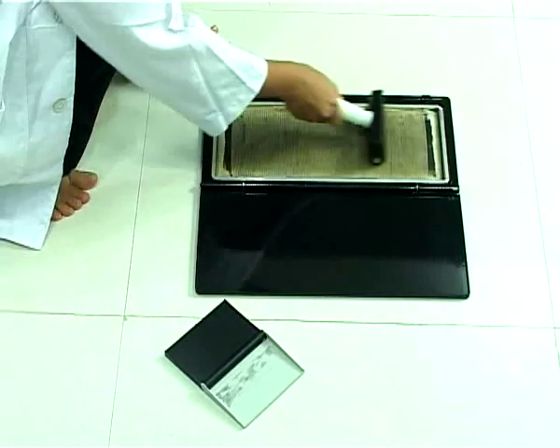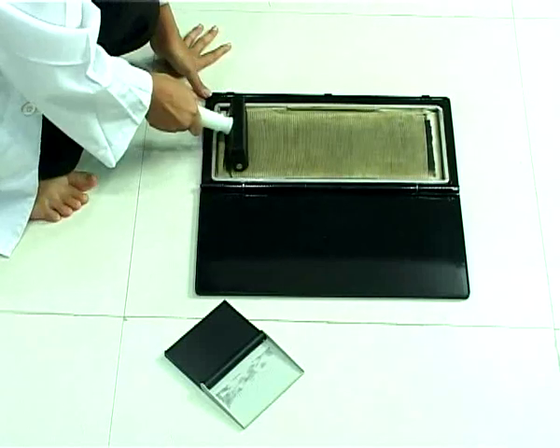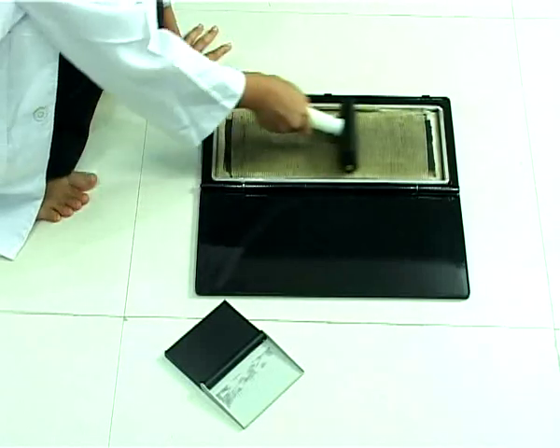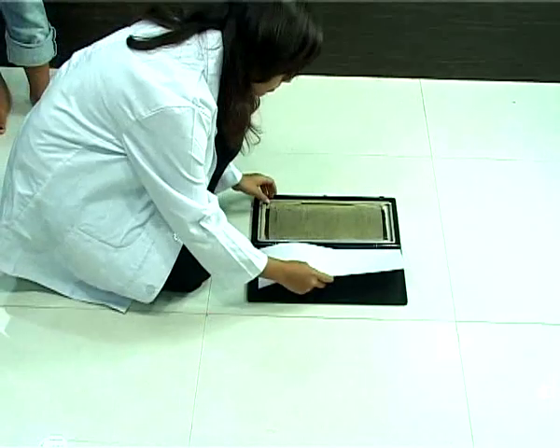Transfer the ink to the grid area of the foot imprenter or Harris mat by rolling the roller on it. Gently roll the roller for longer life of the mat.